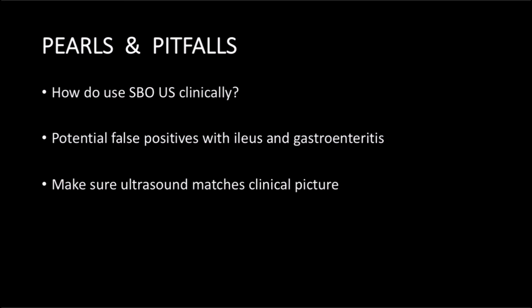The biggest question I receive when discussing non-classic ultrasound applications, which likely include small bowel ultrasound, is how do we use this clinically? My answer in these cases is that we as clinicians want more information in order to make the best decisions regarding testing, treatment, and disposition. I think ultrasound provides more information that we can utilize at bedside within that existing framework.